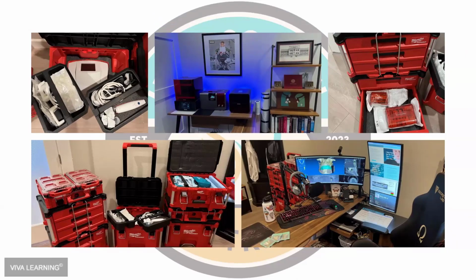So when I was in Phoenix, this was my setup. I had my home office. There you can see a screenshot on the bottom right of what AIS 3D looks like. That means I could bring in any CBCT DICOM set into the Acteon software, and I planned my cases, occasionally printed guides, as you can see my 3D printers in the top middle photo. And then I would travel to offices with these 3 Milwaukee packouts that barely fit in the SUV I was driving. And I would do about 2 or 3 times a week. I would be on the road doing surgeries, and it was a lot of fun.